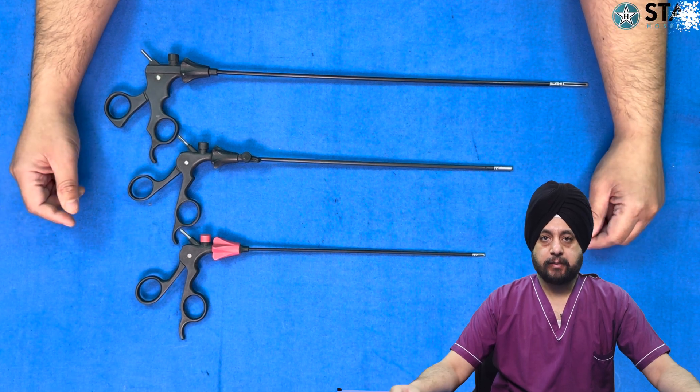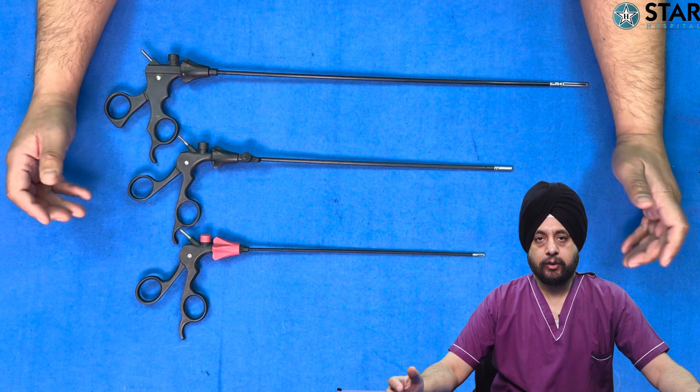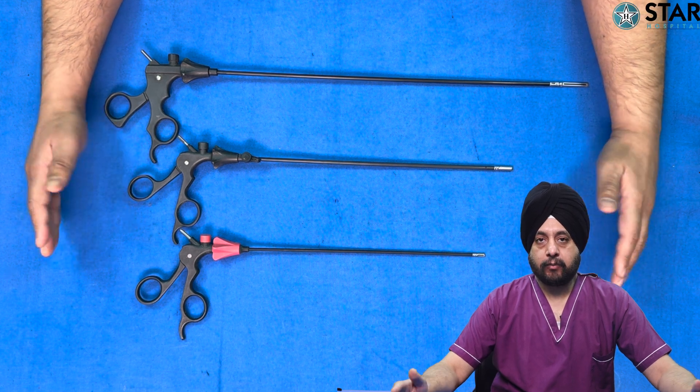Hello friends, today we will discuss about routine laparoscopic instruments. We will not include special instruments like those used in gynae, coagulation instruments, or advanced instruments. These are just routine laparoscopic instruments that we use for normal laparoscopic surgeries.